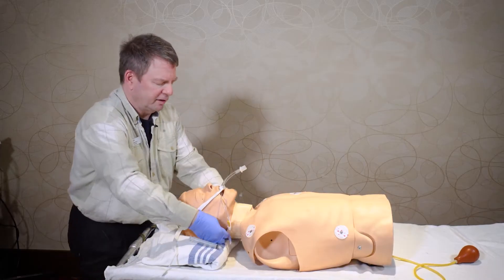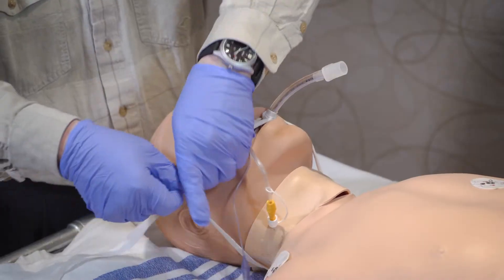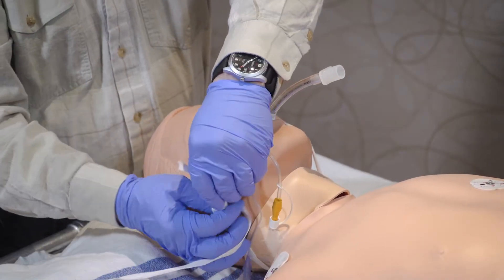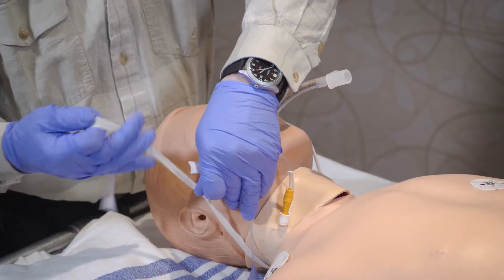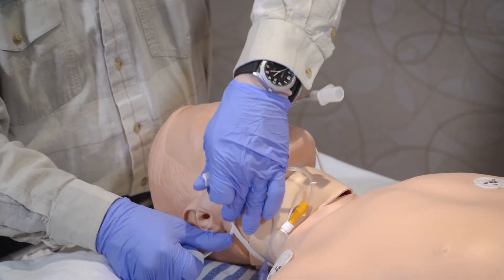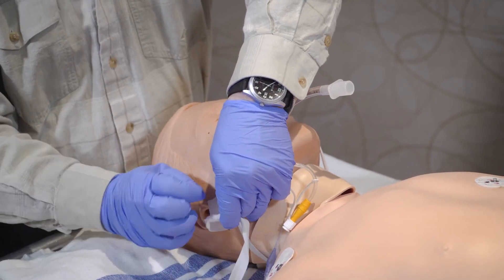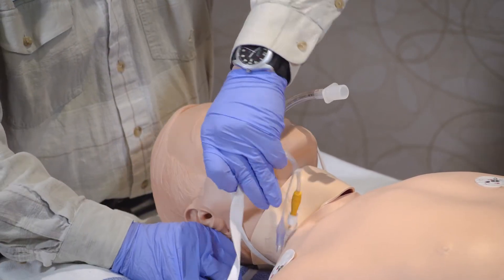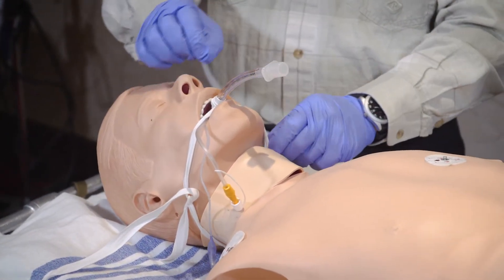Then you would bring the ties around the neck and secure with a simple knot on the side of the face right where the jaw line is. If needed, somebody could hold their finger there to keep the knot from untying while you make a double knot, and that will prevent the endotracheal tube from dislodging, keeping it in place.